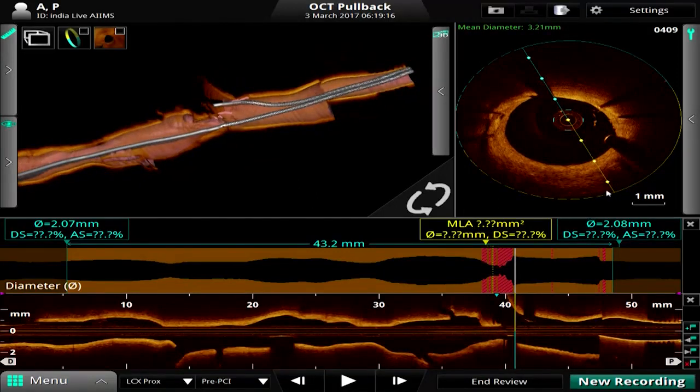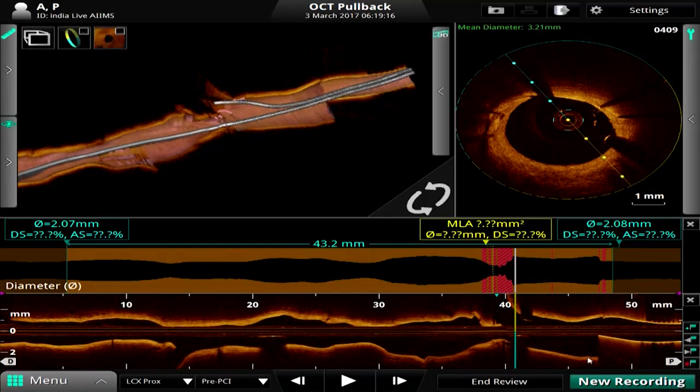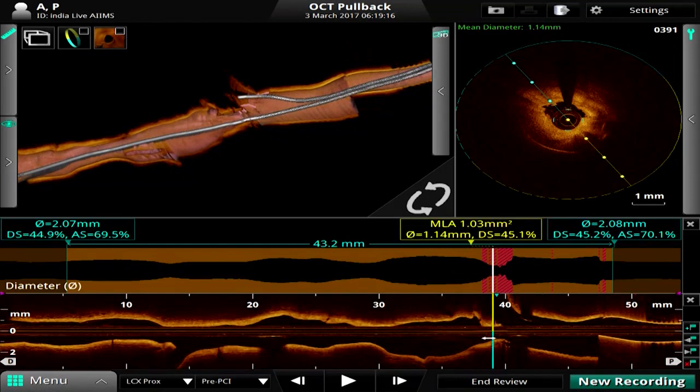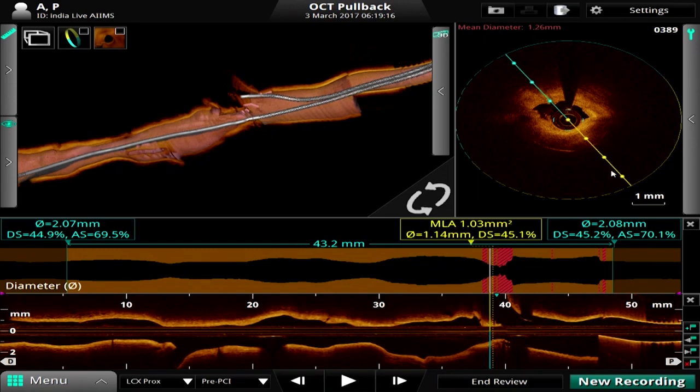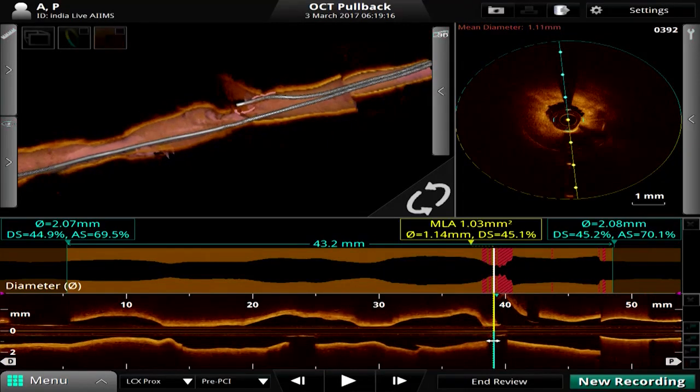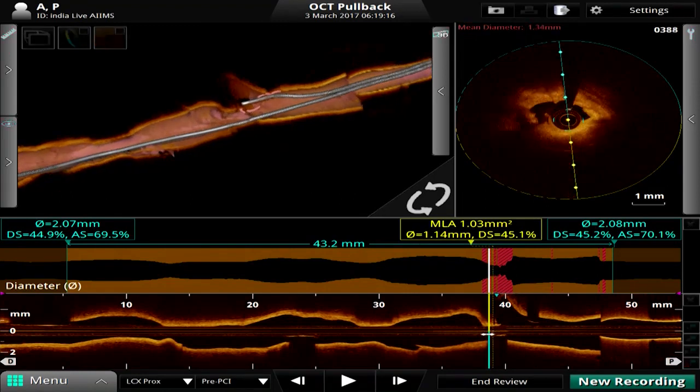Here you might see when we are turning the wire going into the LAD, a very limited, few 4 or 5 millimeters, very narrow stenosis, with an MLD of around 1 millimeter. So the point is, can we open a little bit more with a larger balloon now? That is the type of information we might have. We can put again a 3 millimeter NC. What is the size, 2.5? It is a 2.56. So 2.5 as the NC, the maximum diameter we'll try, again, and see if it works.